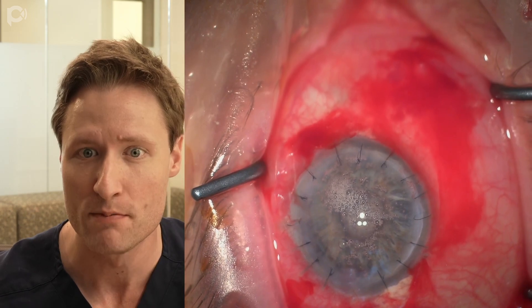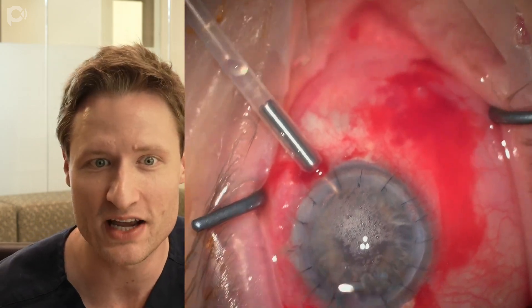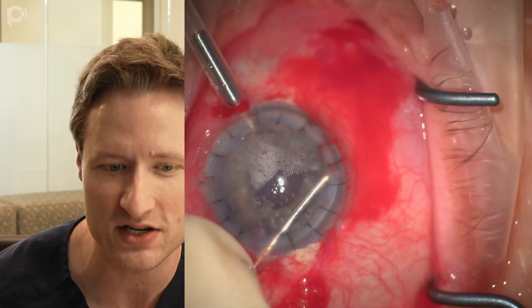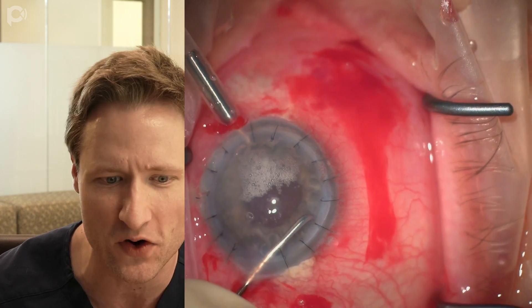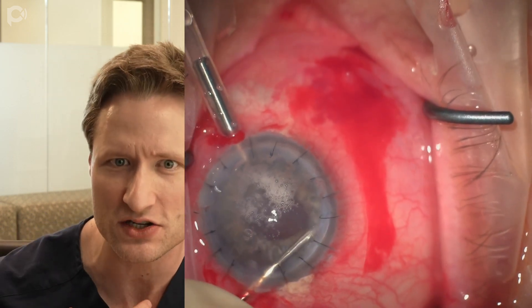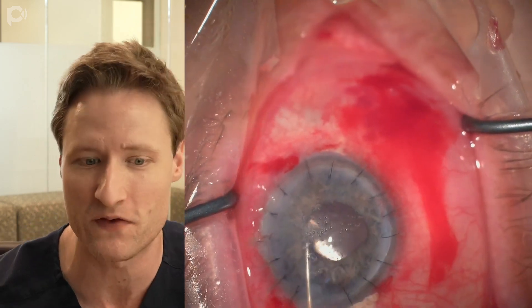Now I'm injecting preservative-free lidocaine into the anterior chamber, as it's been a few minutes since the start of the case. Next is potentially the most uncomfortable part of the procedure: making a peripheral iridotomy. The AC maintainer is now connected to a syringe with balanced salt solution, maintaining the AC with saline. I'm using the Ertli capsulorhexis handpiece to make a far peripheral iridotomy. It's tough to see the iridotomy because of the opaque edge of the PK, so for safety I'll make a second one — if I can't see the patency of the PI clearly, I just make a second because it's quick and easy. I like the Ertli handpiece for this purpose because it cauterizes a hole in the far peripheral iris with usually very little bleeding. It's one-handed, facile, and easy to do.